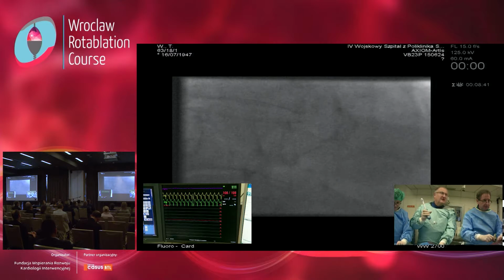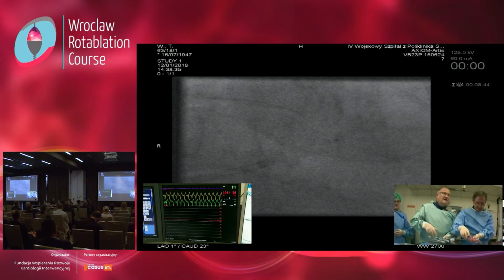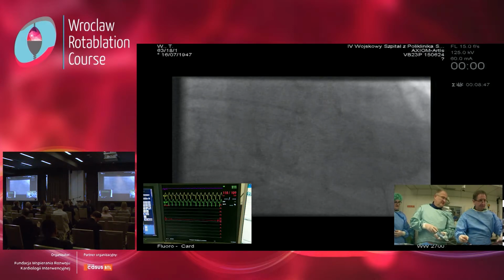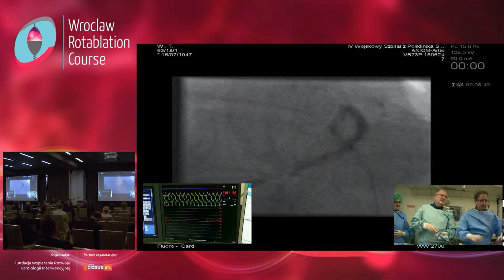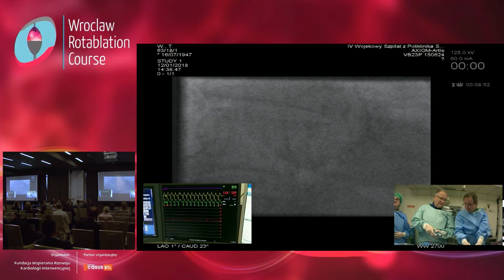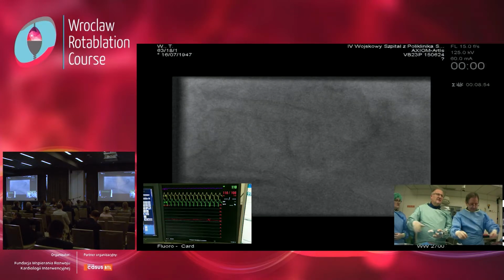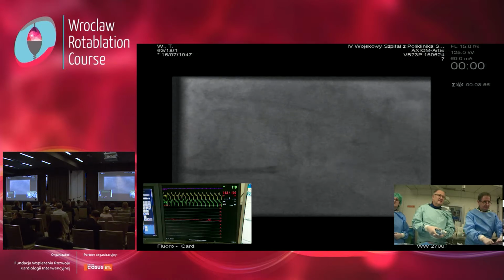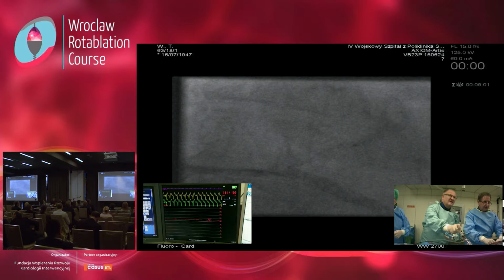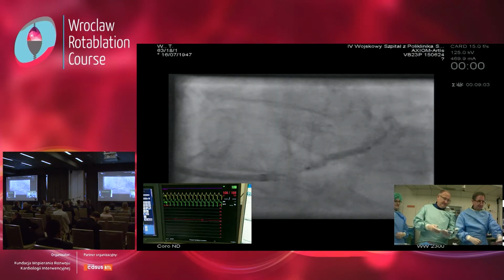So we go now, I don't know, here's like a spider view, not good to see. I'm just going a bit back with the wire. Check. Okay. 16.